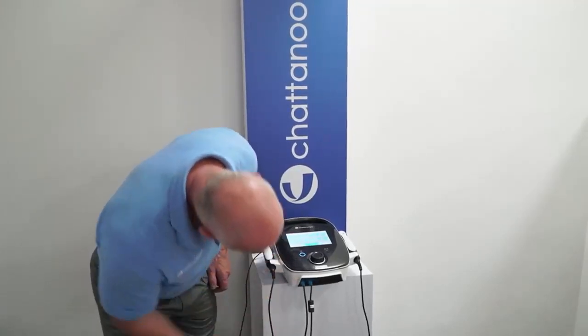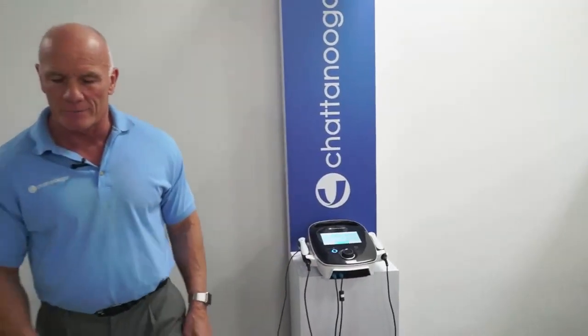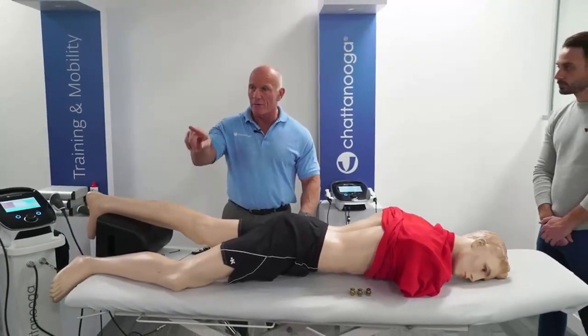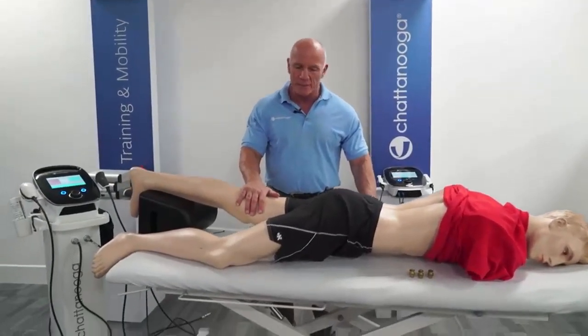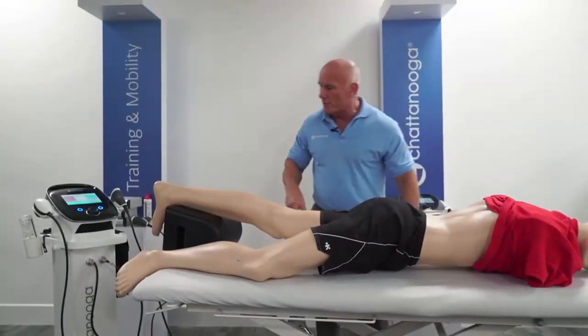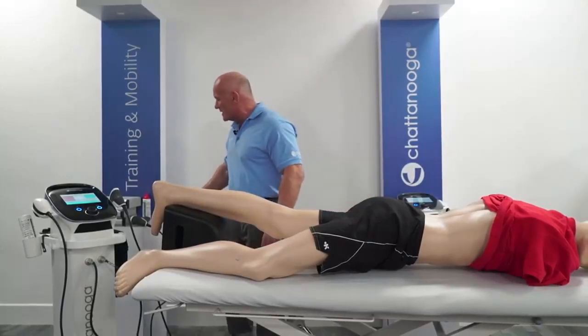Okay, so let's just have a look now at ultrasound therapy, in particular the treatment of osteoarthritis of the knee. That's a big presentation we see in our clinics.